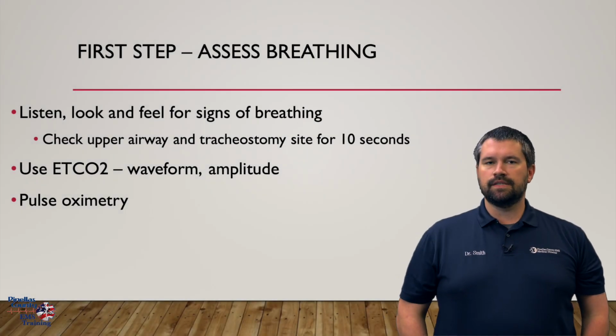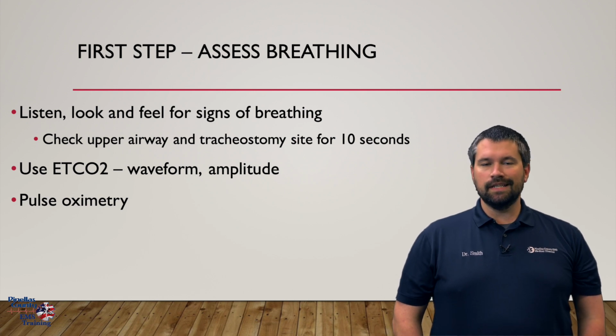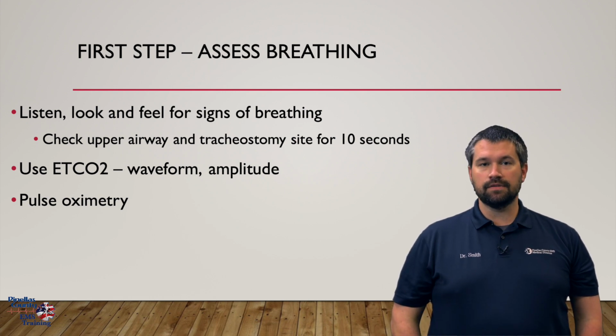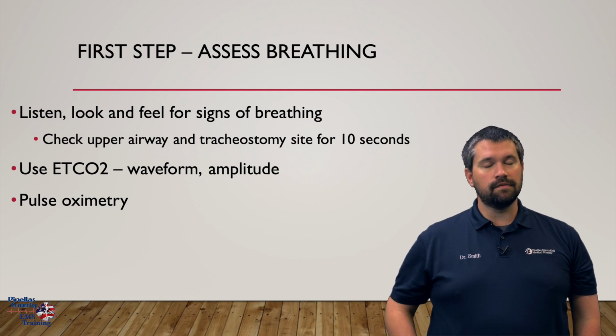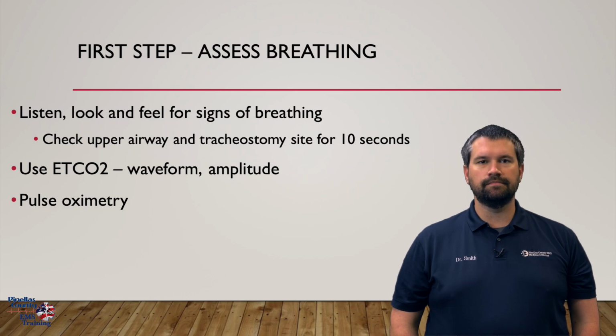So the first step in assessing your patient with a tracheostomy is to assess the breathing. Look, listen, feel for signs of breathing. Check the upper airway and tracheostomy site for at least 10 seconds. Use end-tidal CO2, including the waveform and the amplitude, and also assess pulse ox. Very similar to our standard patients when you're assessing their respiratory status.